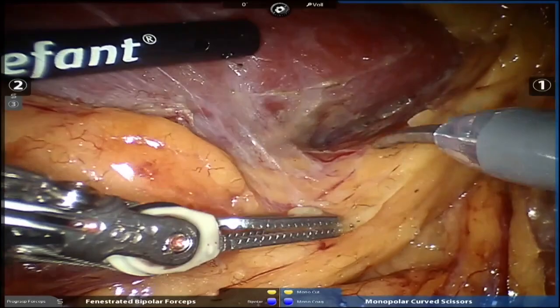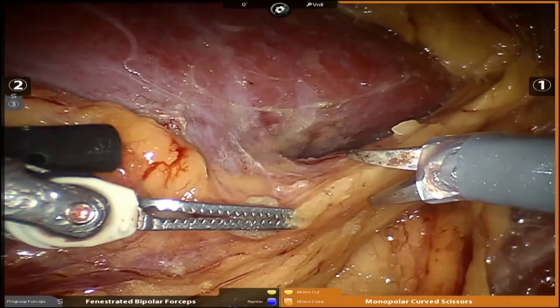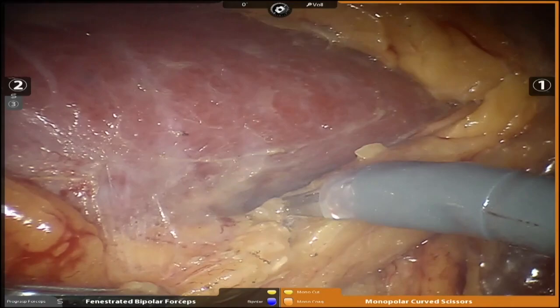All right, so this tumor goes all the way. It's a big tumor, it's almost the whole kidney here. We're not going to have a whole lot of kidney left when we're done here. But that's okay.